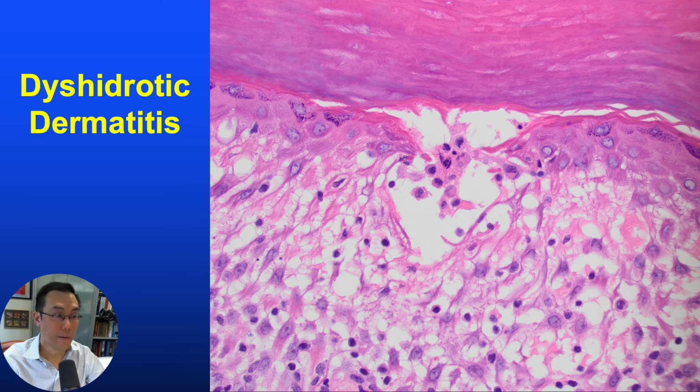And with that thick, compact stratum corneum, it's easy to see that that spongiotic vesicle is going to stay intact for a while. But, truth be told, I suspect that intact spongiotic vesicles is more a function of the anatomic site rather than a function of dyshidrosis per se, beyond the fact that dyshidrosis is essentially limited to involvement on acral skin.